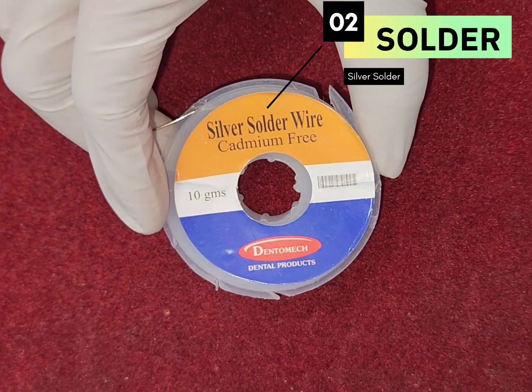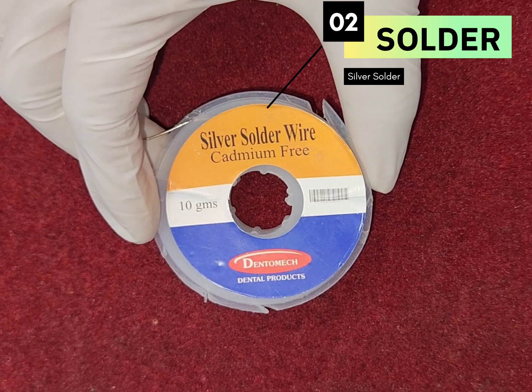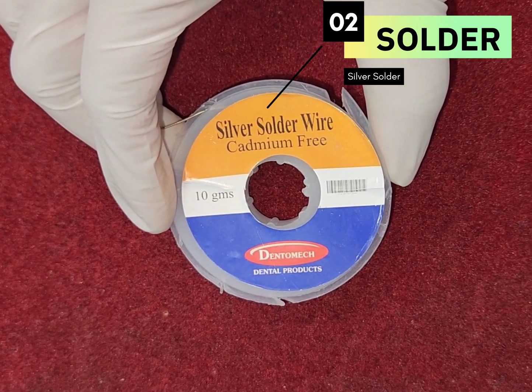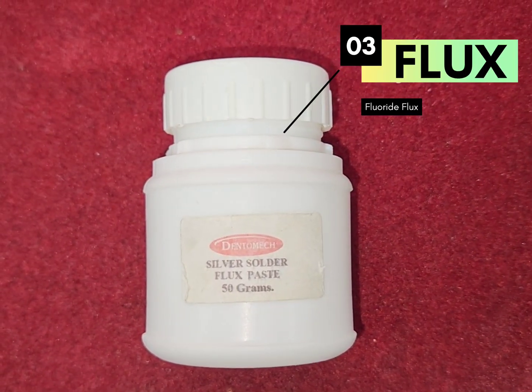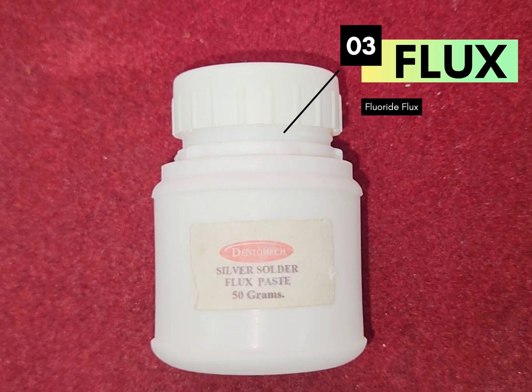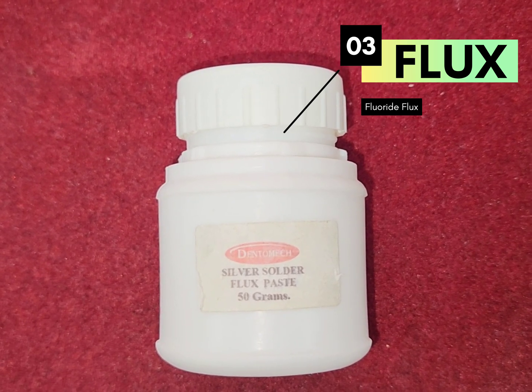Solder, or filler metal, is used to join two parent metals together. We are using silver solder to form a solder joint with stainless steel wire. Flux is used to remove oxide coatings present at the parent metal surface, either by dissolving oxides or by preventing further oxide formation, thus creating a smooth surface.